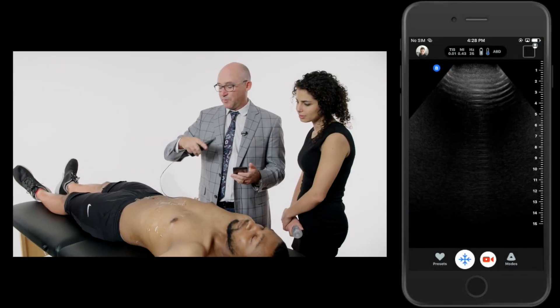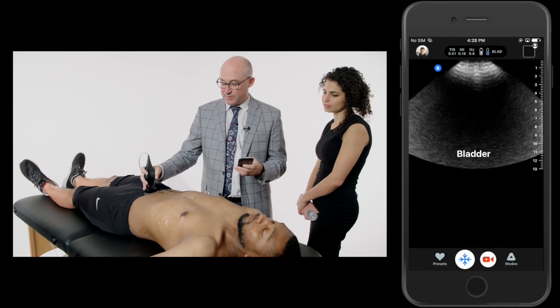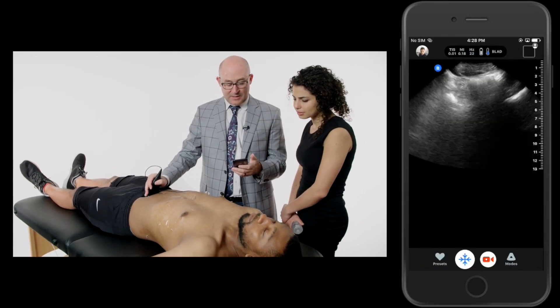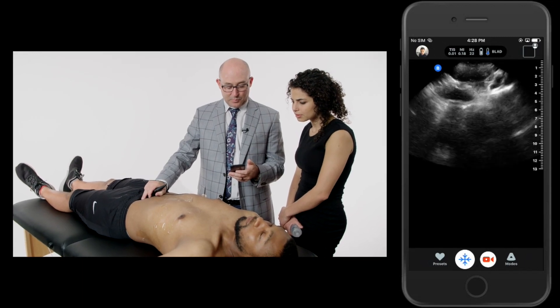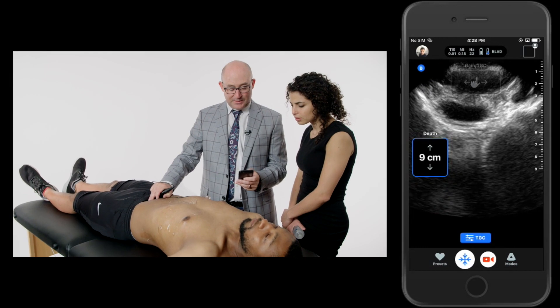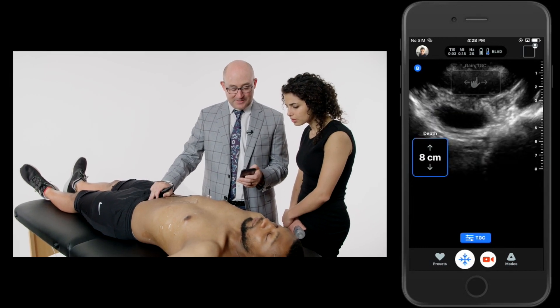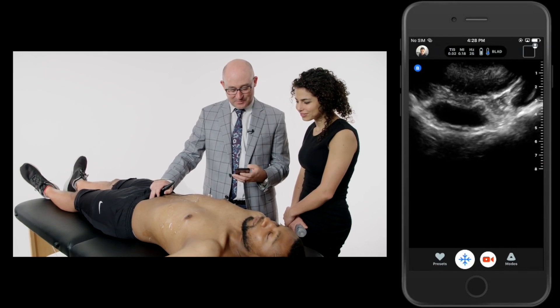Now I'm going to go ahead and look at his bladder and put that preset on. It takes a second to switch over the preset. I'm fanning inferiorly, and this is where his bladder is — pretty empty, but I found it. I'm going to go ahead and decrease that depth. It's only got a cc or two in it, but that's the idea. You can see the bladder there, the anechoic structure on the screen.